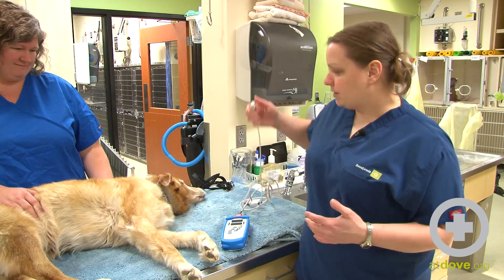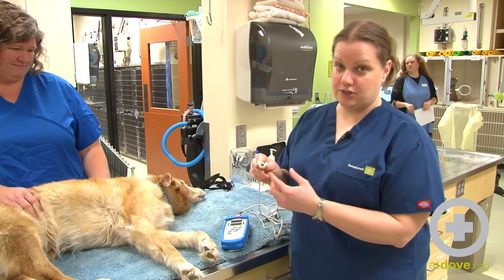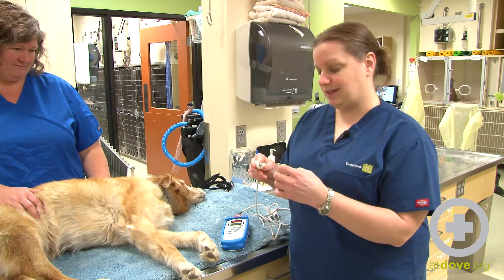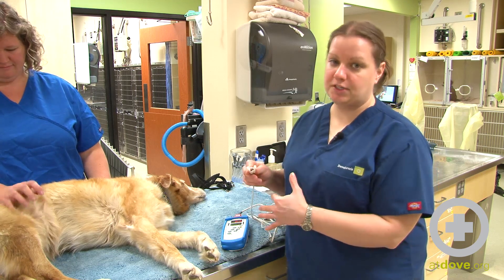So how this works is this little probe here has a light that shines, and this light is actually passing through the blood. That is what it's refracting off of — that hemoglobin and oxygen — and that's what's going to give you your number.